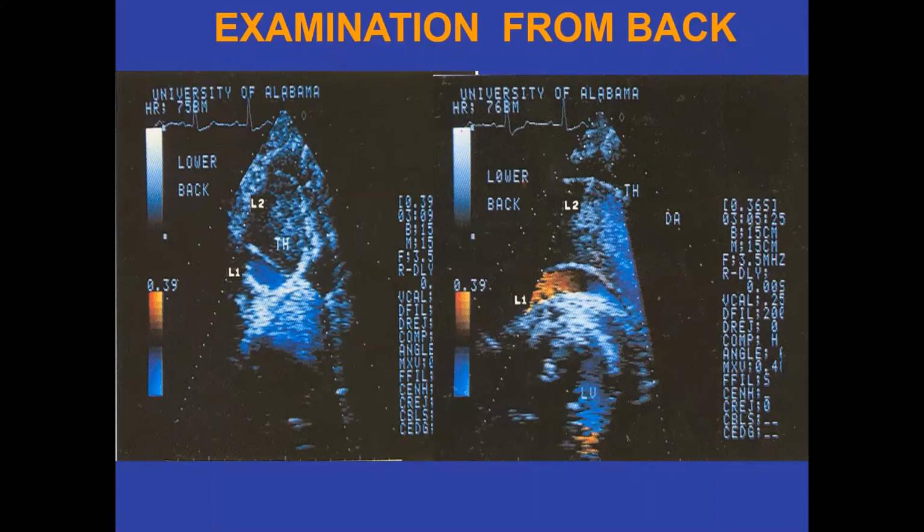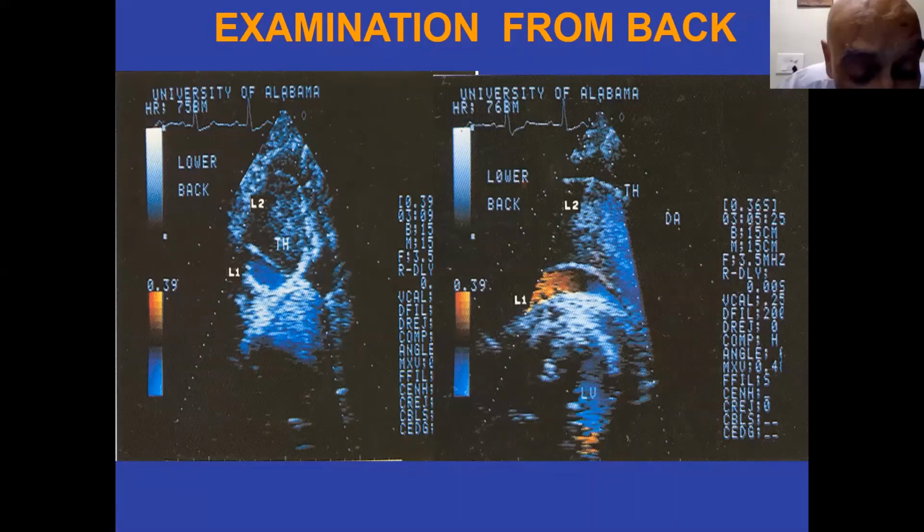Sure. So next, Shubhra is requesting some tips in case of dextrocardia. Yeah, a very, very important question, dextrocardia. It looks very difficult, but it's not very complicated. All you have to do is turn the patient right.